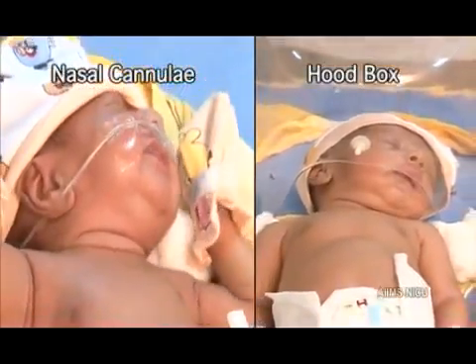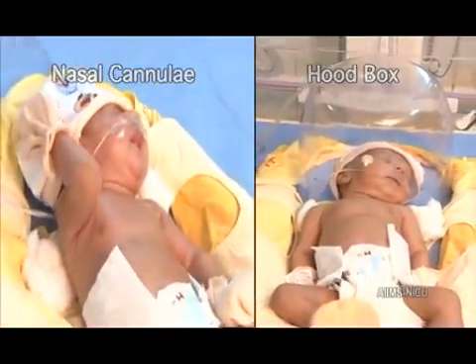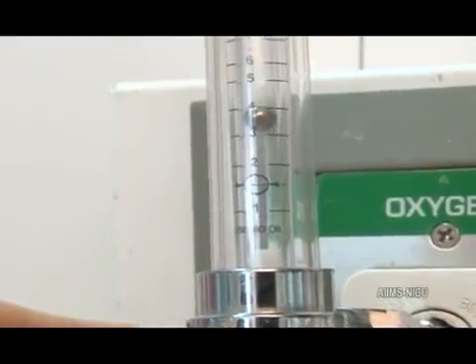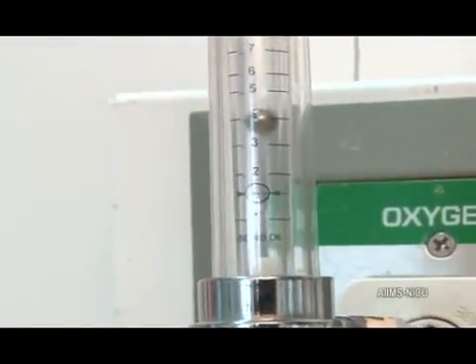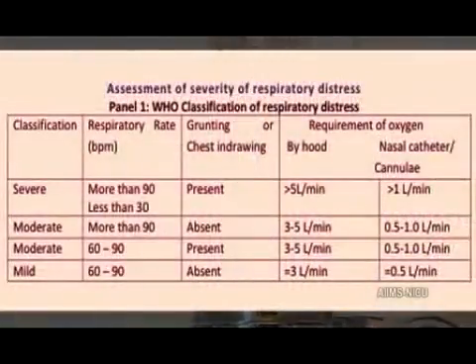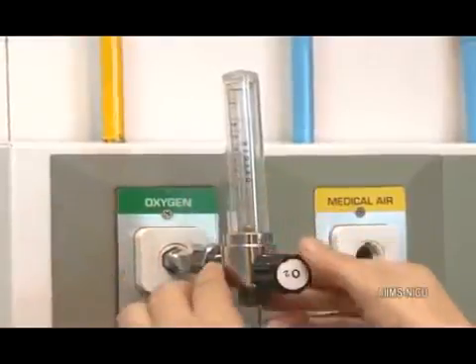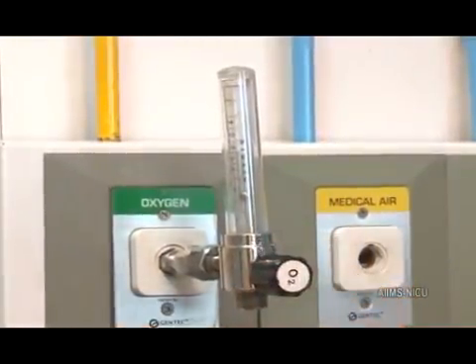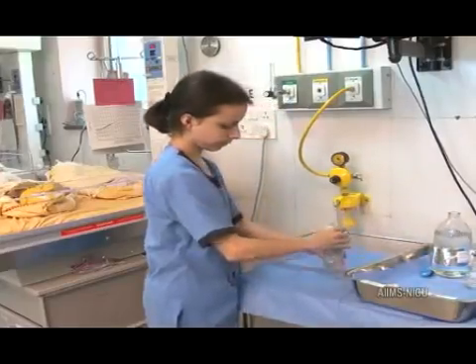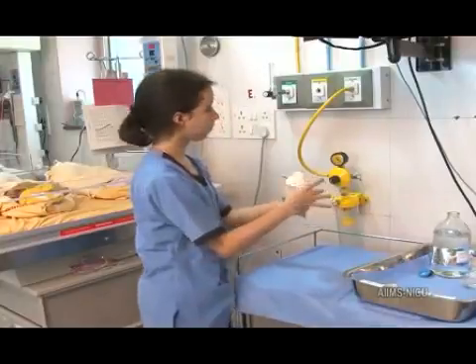It can be administered by nasal cannulae or by oxygen hood. The flow rate of the oxygen depends upon the device used and the degree of respiratory distress, as can be seen in this algorithm. Attach the oxygen tubing to the oxygen cylinder or to the central oxygen supply. Fill the humidifier with distilled water so that the oxygen delivered is humidified and not dry.